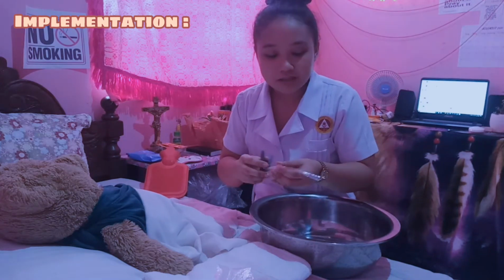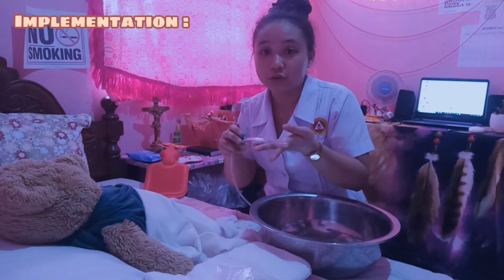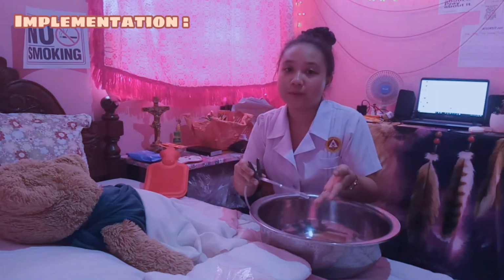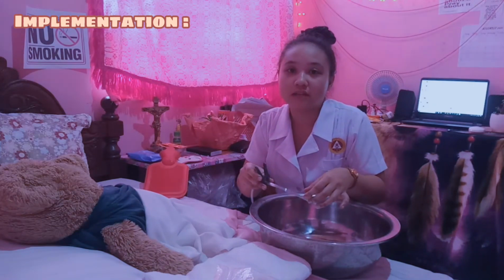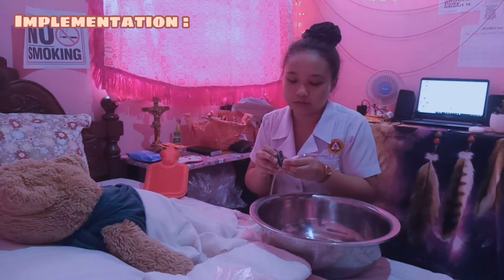And then run some solution through the connecting tubing of a large volume enema set and the rectal tube to expel any air in the tubing, then close the clamp.